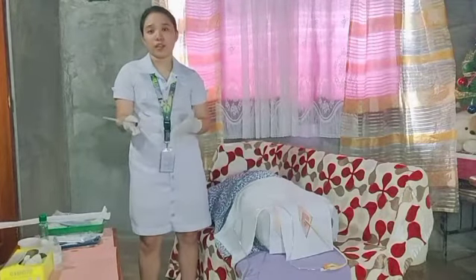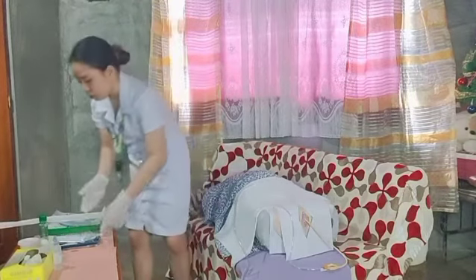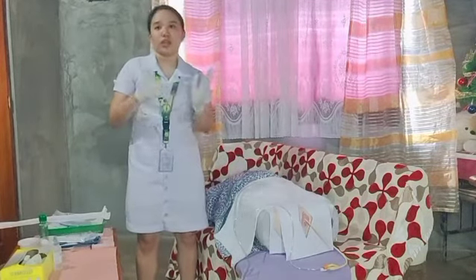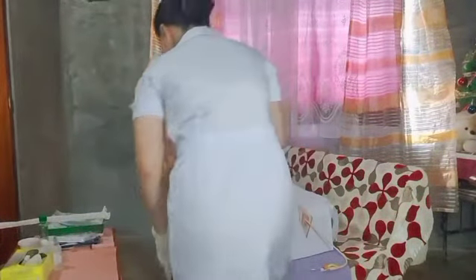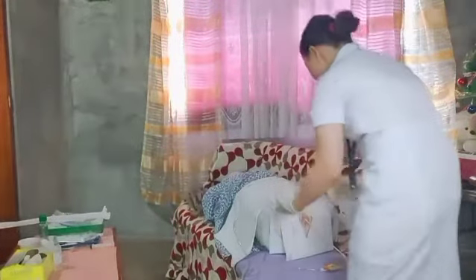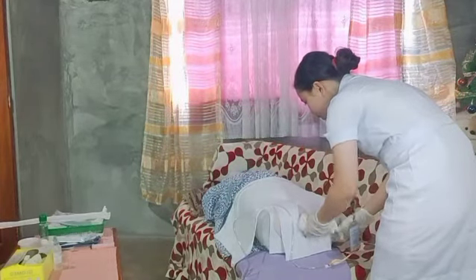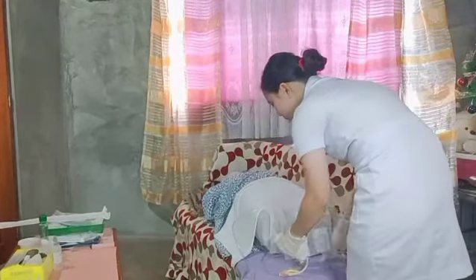After getting the sterile water out of the balloon, we will, with your free hand, catch the end of the catheter with tissue and wipes. So, ma'am, hinga po tayo malalim. Okay. So, for example, this is our tissue. Okay. Hilain na po natin, ma'am. Okay. And discard. Okay.